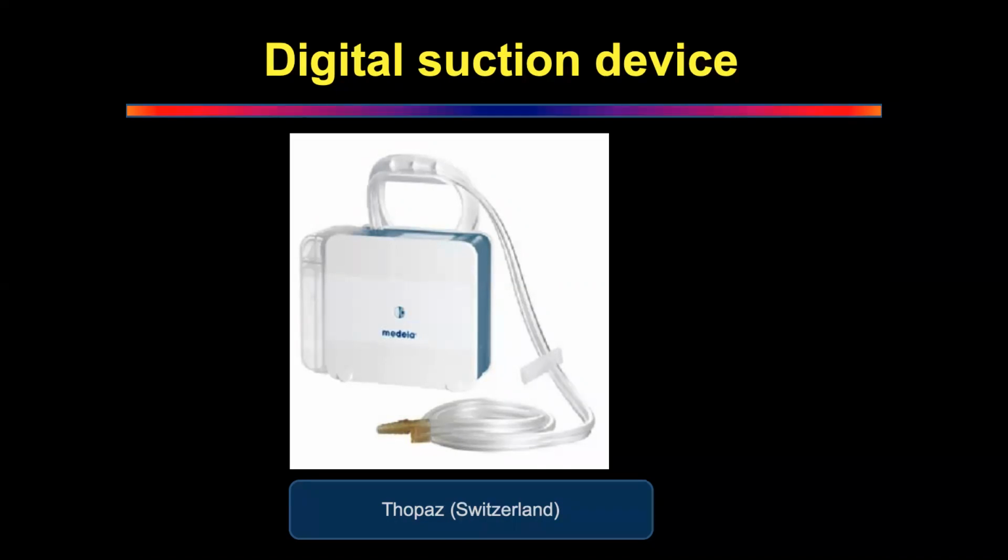Yes, sir. Every line of it is important. One question, sir. Is it a double lumen tube? Yes, it has two lumens. One is for fluid and one is for the suction to be applied. It's an inbuilt system where one applies the suction and the second one allows the contents to come out. It also has an inbuilt flushing mechanism, which flushes the system regularly.